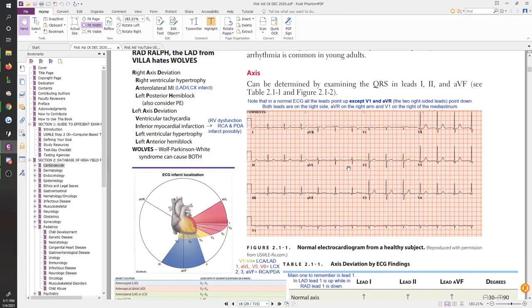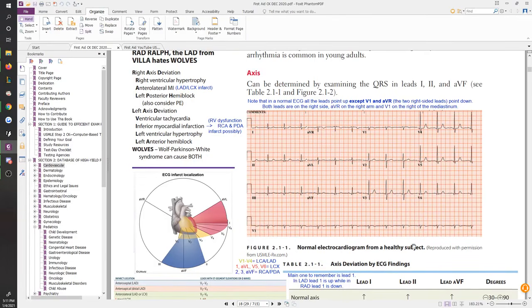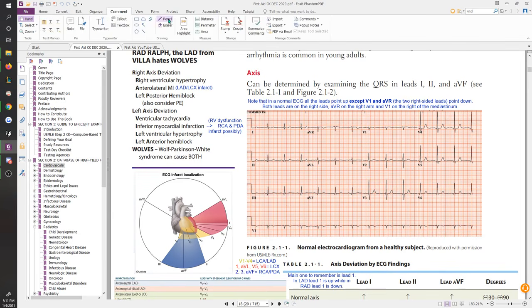So let's look at this blank ECG over here and assume you were given an ECG, right? So here, this is your normal ECG. Let me grab my pencil. So this is your normal blank ECG from a healthy subject. And of course, different ECGs you might get that are pathological might have different presentations, right? This is only going to be true for a normal patient, and for other ones, you're going to have other things that you heard of in Step 1, such as ST elevations, ST depressions, messed up rhythms, right? Or you could have fibrillations where you have too many P waves, or the flutter sign, and so on and so on.